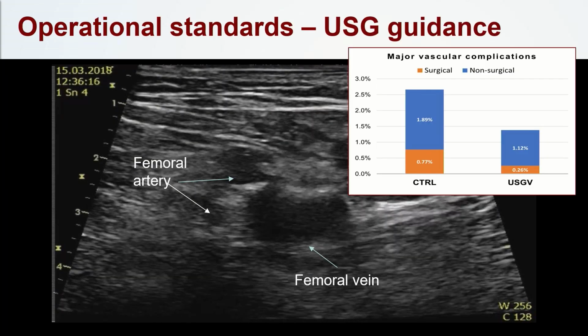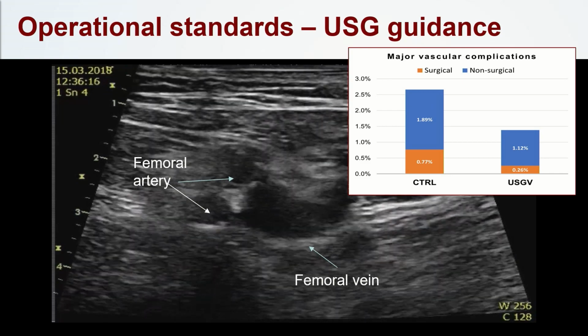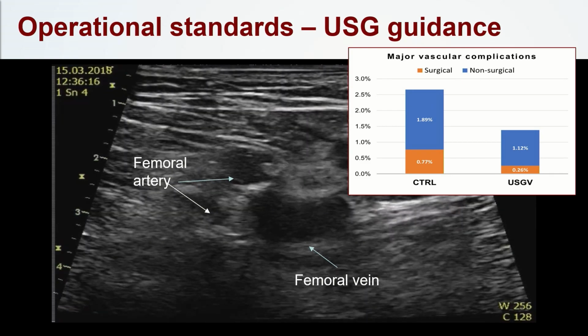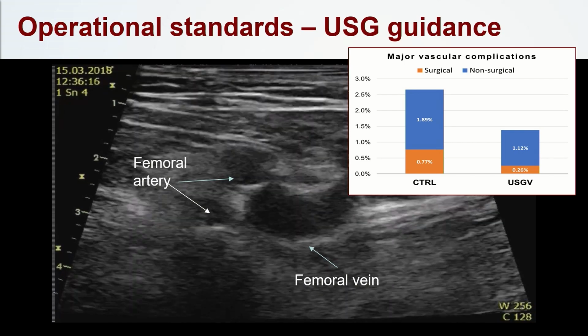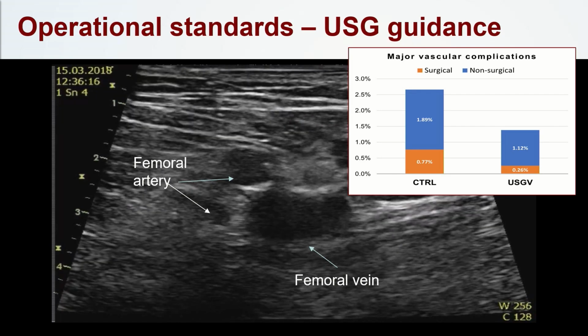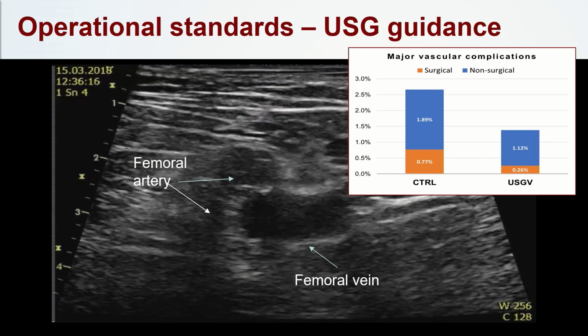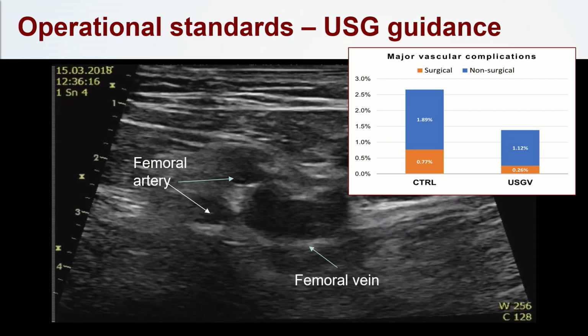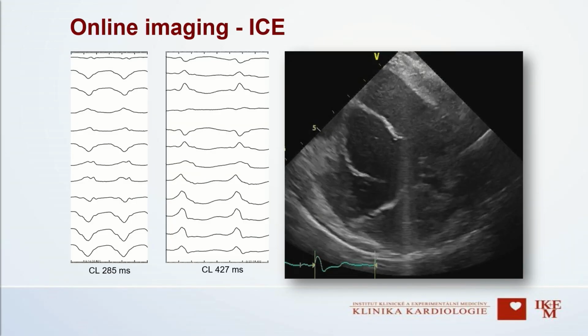Operational standards. There was a lecture of Tom de Potter, how you can minimize complications and speed up the procedure by use of ultrasound. We analyzed again a large cohort of more than 4,000 patients, and you see that the complication rate was significantly lower when you use ultrasound, especially surgical complications.